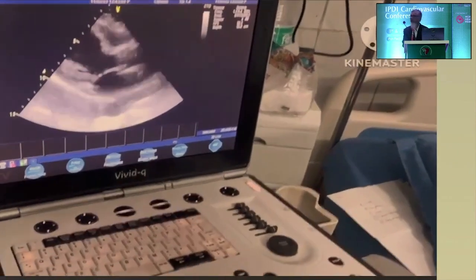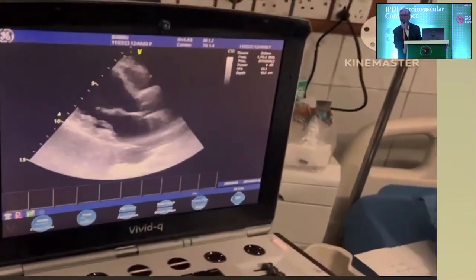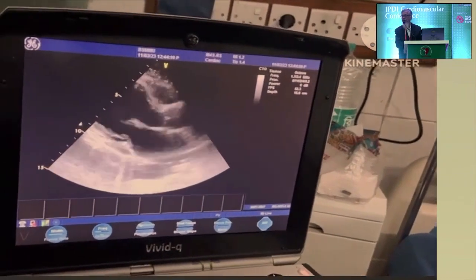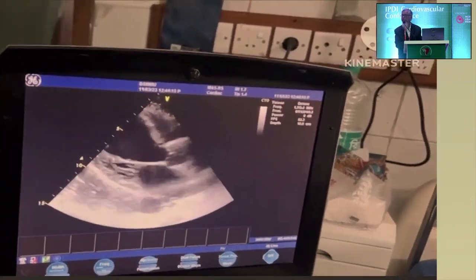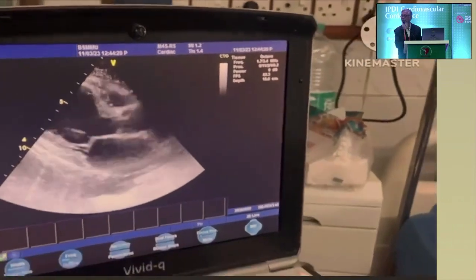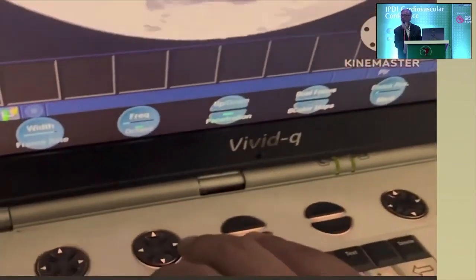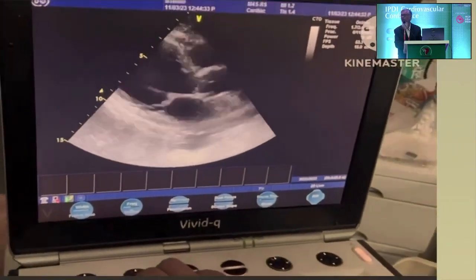grayscale really enhances the visualization of the myocardium. Look very carefully before compression and after compression of the anteroseptal wall. There is certainly some increase in grayness in the walls that will help you understand the motion. Initially, we could not appreciate much motion in the posterolateral wall, but with increasing compression, by increasing the grayscale, we can now visualize the wall motion better.